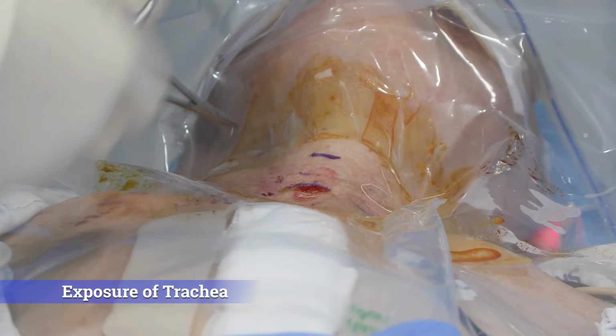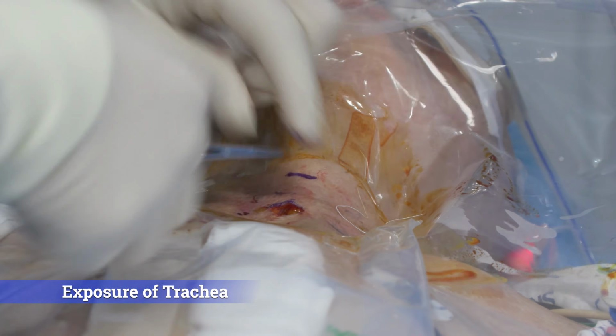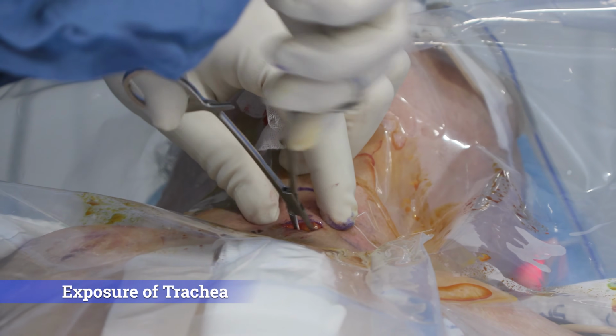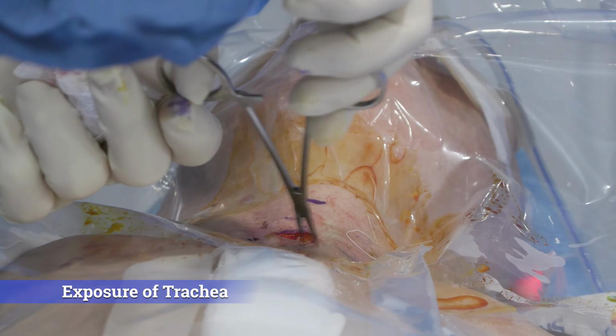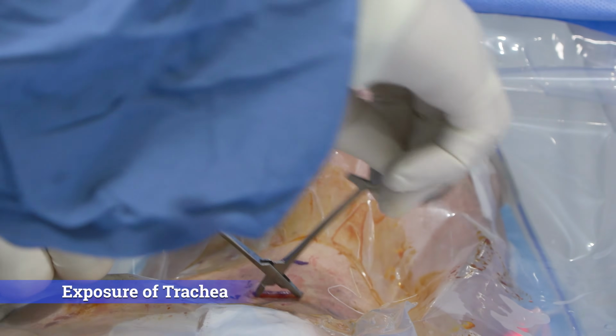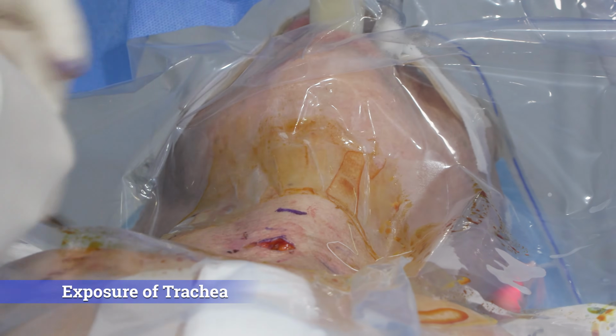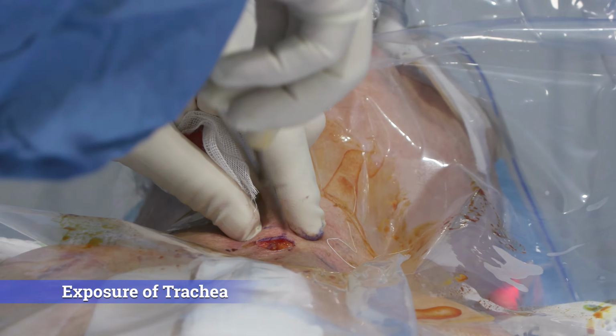An electrocautery device is prepared for hemostasis, but in most cases dissection with only a mosquito forceps is sufficient to expose the trachea. Once the trachea is exposed, the endotracheal tube is withdrawn slightly from the patient's head side so that it does not obstruct the site where PDT will be performed.